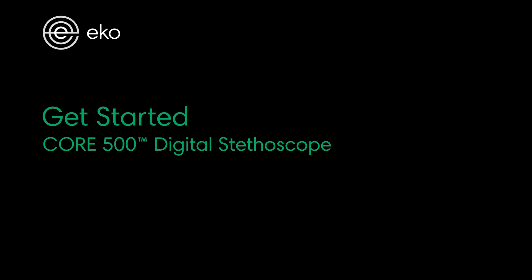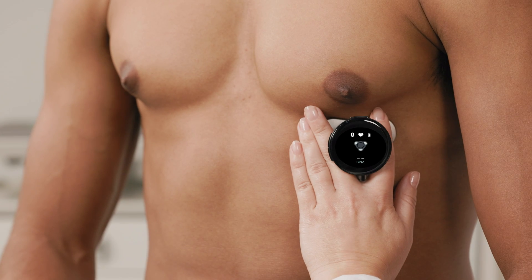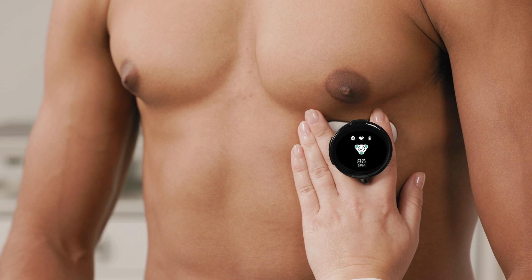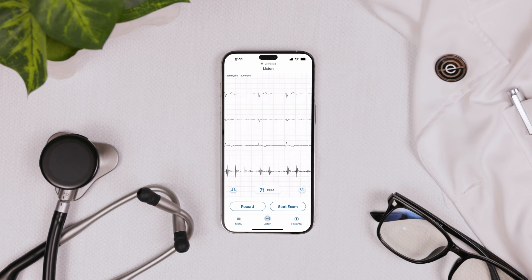Hey there. In this video tutorial we're going to show you how to get started with your Core 500. The Core 500 is a digital stethoscope with a digital display, live heart rate and 3 lead ECG. We'll show you how to set up the device and understand its features.